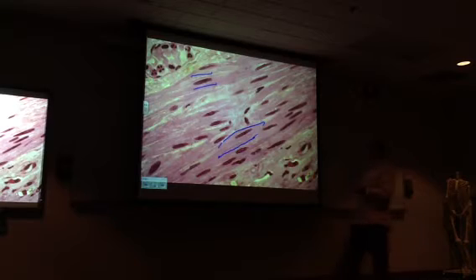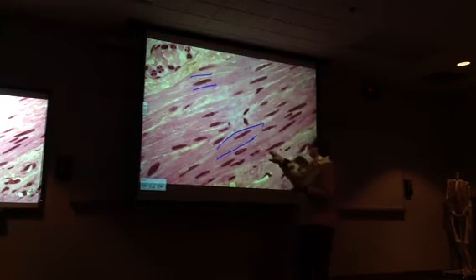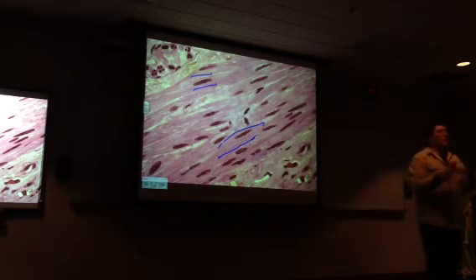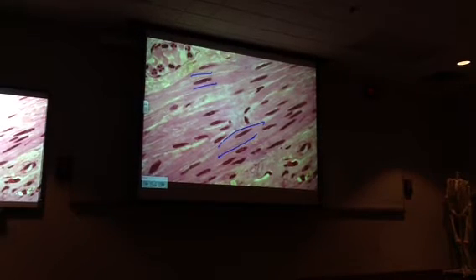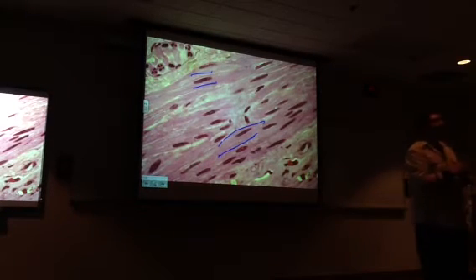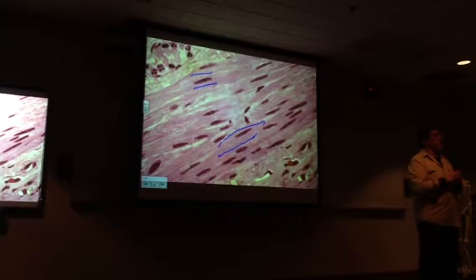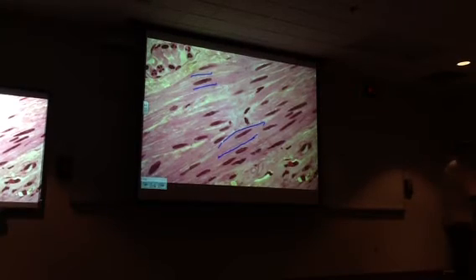And I also look at them and sometimes see the nuclei look a little bit scrunchy. And remember, when smooth muscle contracts, in the same cell, maybe only part of the cell contracts, and other parts don't. And that will tend to give the nucleus that ruffly or scrunchy type appearance. Whereas in striated muscle, when the cell contracts, the whole cell is going to be contracted.